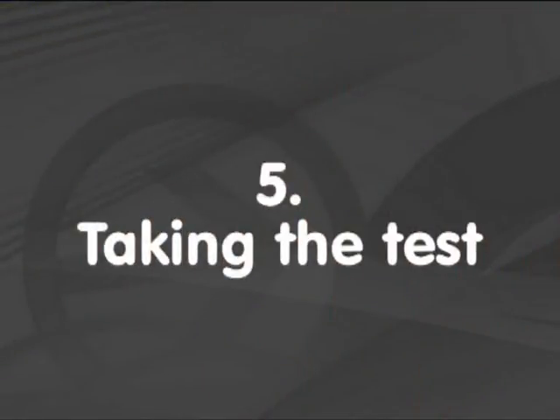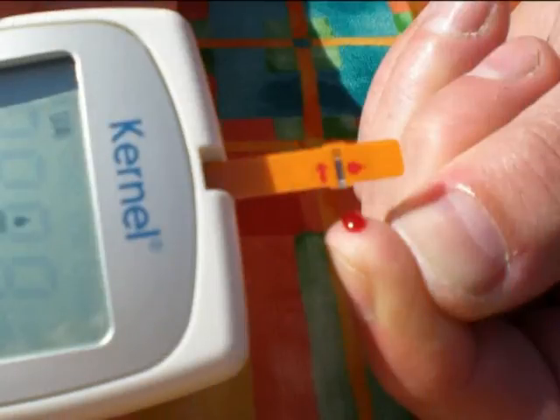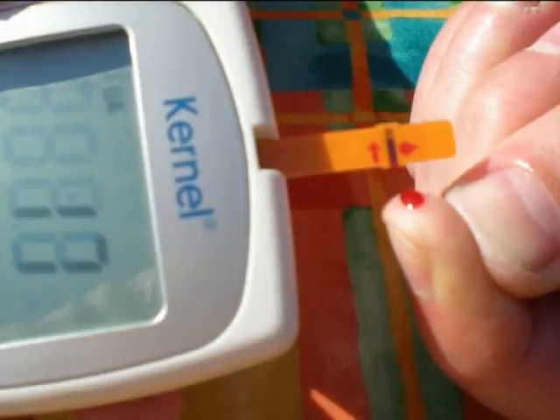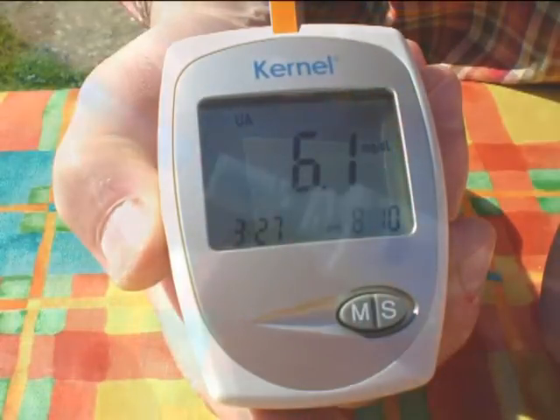Once you have the blood blob at the end of the finger, you then touch the blob to the strip, with the orange side facing upward and beside the arrow on the thin edge. The blood gets sucked in and the meter then bleeps to say it is reading. It is important that once you have taken the test, you should ensure that there is still blood left on the end of your finger. That way you know that there is enough of a sample in the strip. The meter then counts down to reveal your reading. Remember to check the instruction booklet for a full explanation of what your reading means.